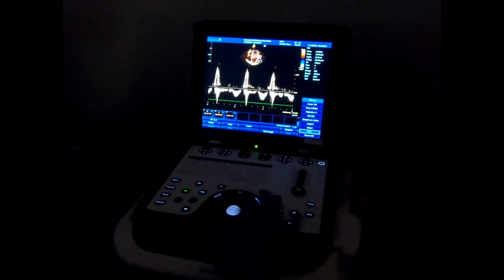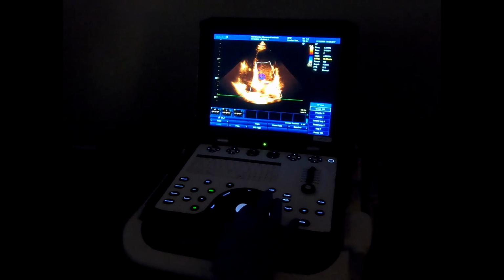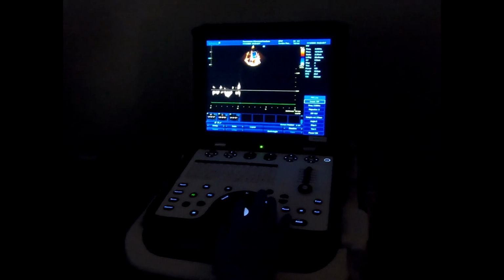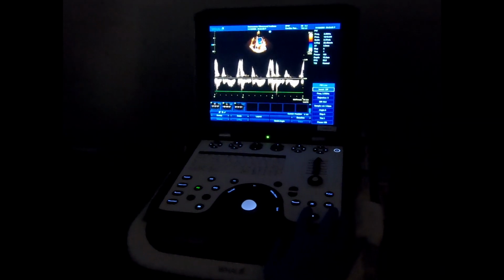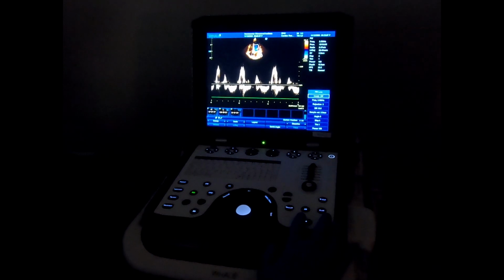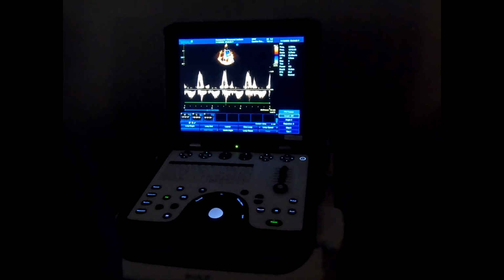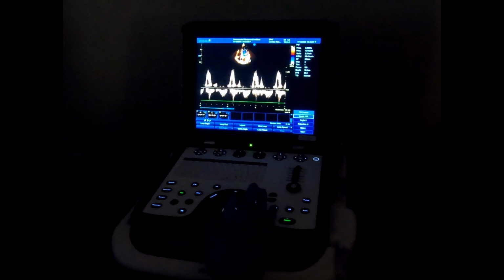So you can do this one, get the A and the E. Yes. So E and A, again, you have four measurements. Here you have the A duration also. So these are little artifacts. You see the peak is bifurcating. You don't go with those.